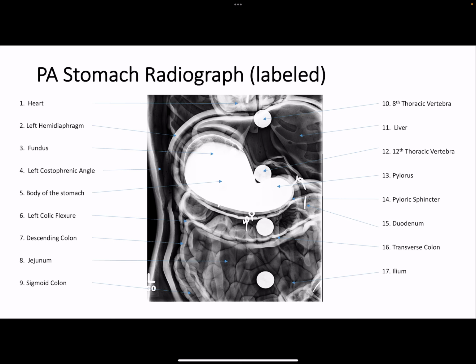Anatomy demonstrated. The entire stomach and duodenum are visible. Items in profile. Nothing is in profile. Pathology best demonstrated. Clinical indications. The PA stomach best demonstrates polyps, diverticula, bezoars, and signs of gastritis in the body and pylorus of the stomach.